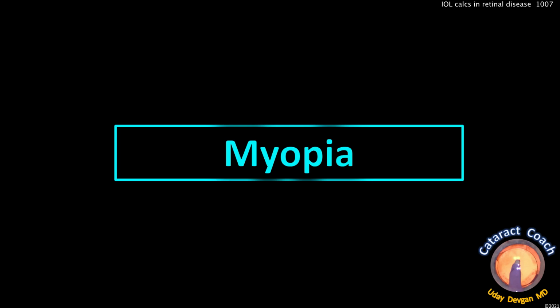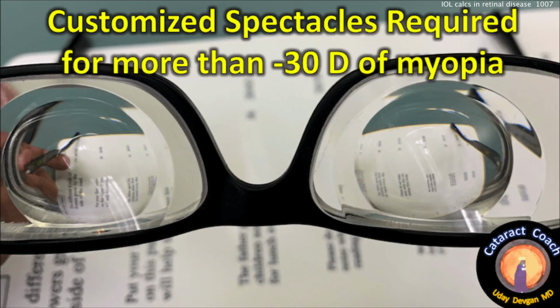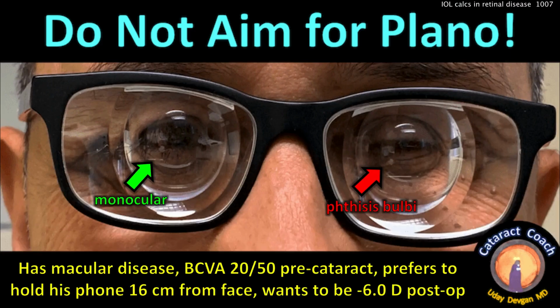How about myopia? So look at this patient. That's an extreme degree of myopia. And you see the big letters there. Do not aim for plano. You can see the customized spectacles that are required to treat such a high degree of myopia. But look at that picture again more carefully.